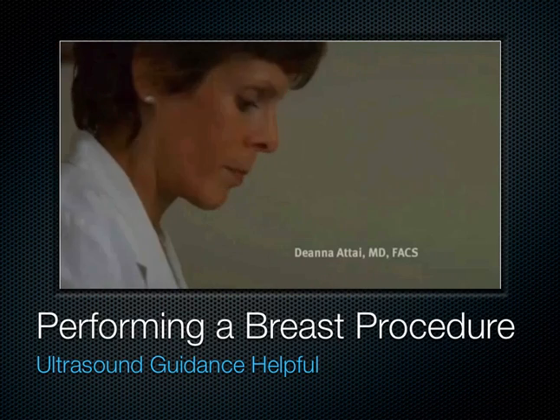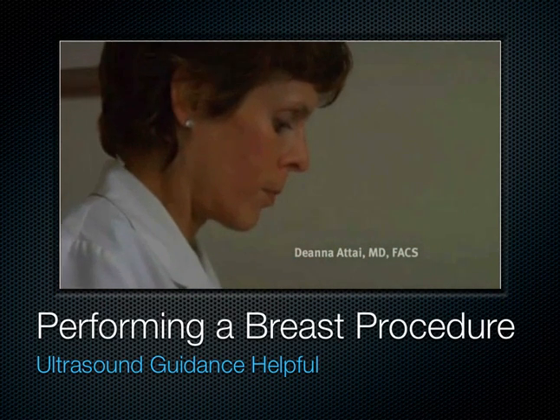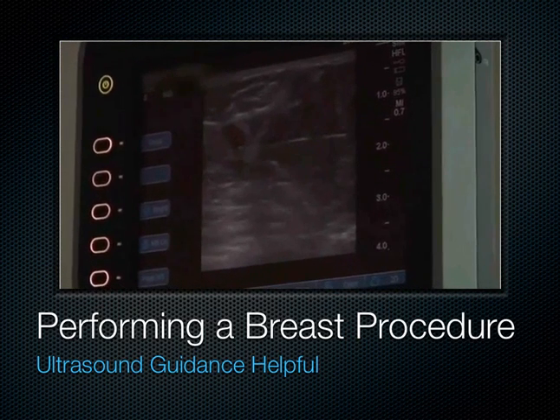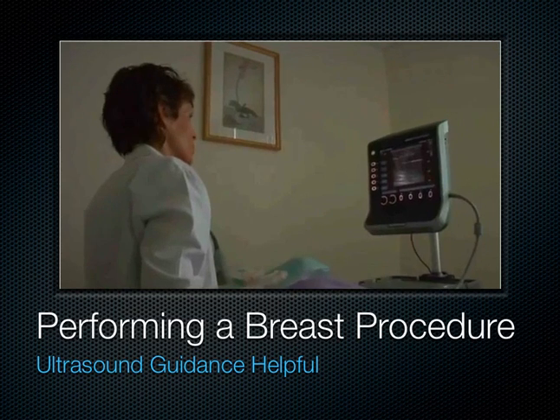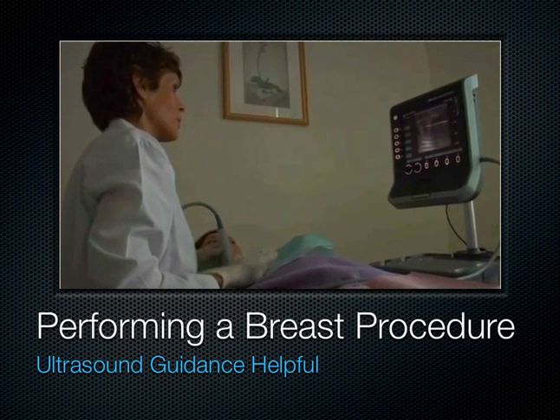Now basically what we're doing initially is just putting numbing medication in, so we'll numb up the skin of the breast and then the underlying breast tissue. Do you feel this? A little bit. Yeah, this is on the other side of it. If you look up on the screen, you can see the fibroadenoma to the right, and then the numbing medication's gone all the way over to the back side right there.